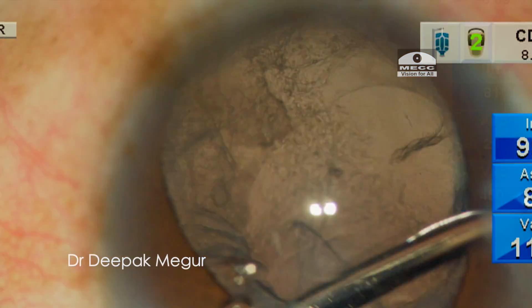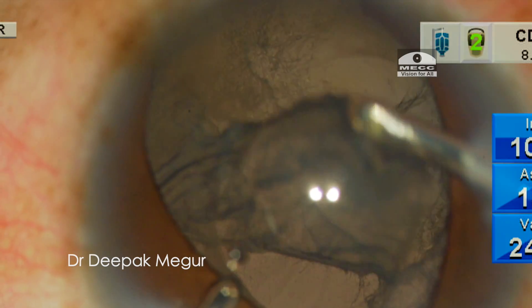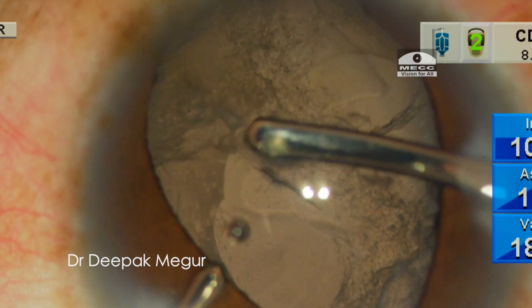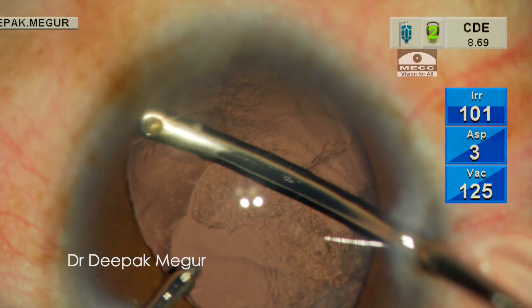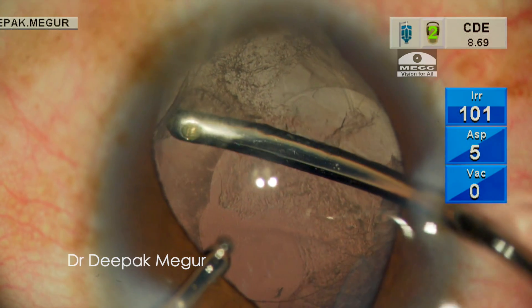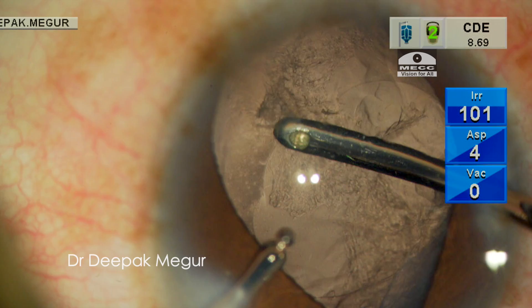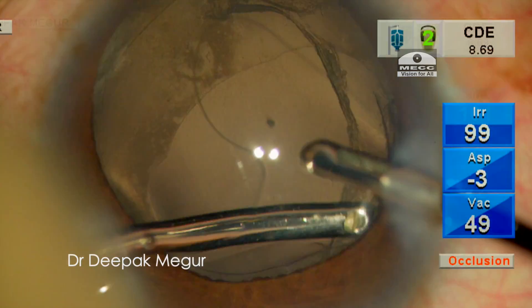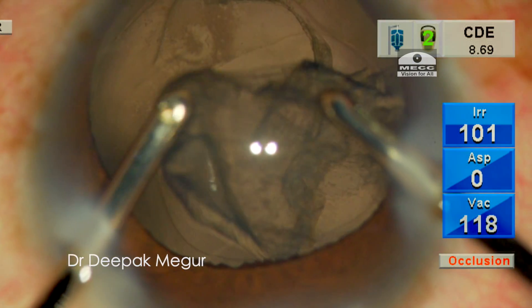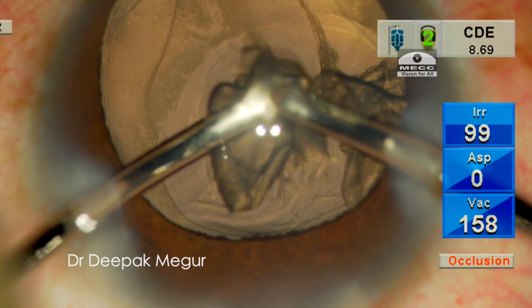The next step is to remove the cortex very gently. As we reach the area of zonular dehiscence, the capsule tends to get engaged in the port. By a process of sequential releasing and re-grasping, the thin layer of cortex covering the area of zonular dehiscence is gently aspirated out. Eventually the cortex is aspirated safely.